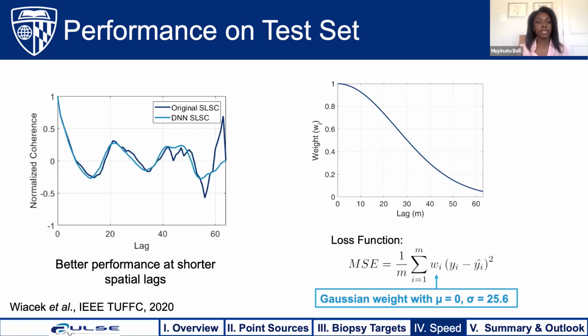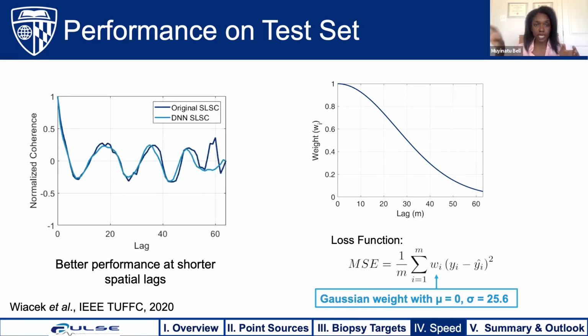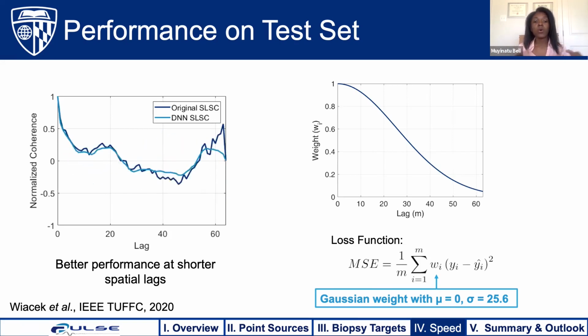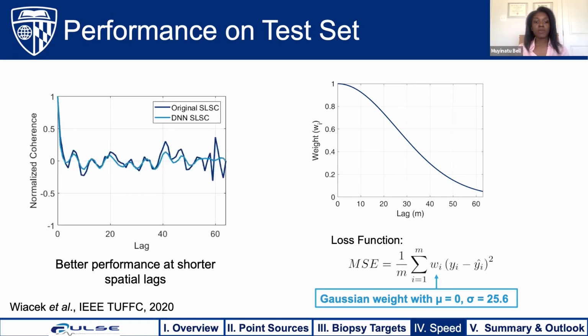And so Cohernet was trained and tested with data from in vivo breast masses, including cysts. And these are the type of masses that we actually want to biopsy for breast patients. And in addition to the in vivo breast mass data that we included for both training and a separate test set that was not included during training, we also wanted to ensure that our network was generalizable across multiple ultrasound data types and across multiple ultrasound system equipment components and configurations.